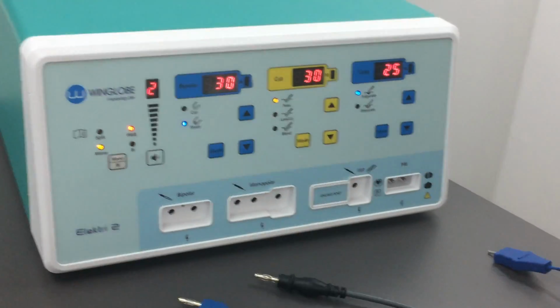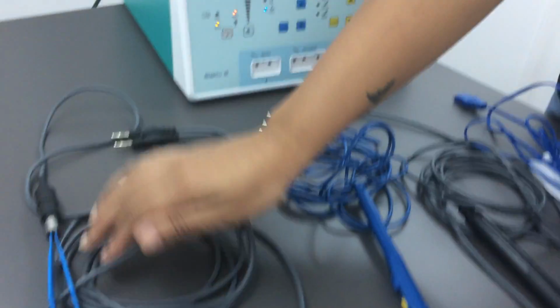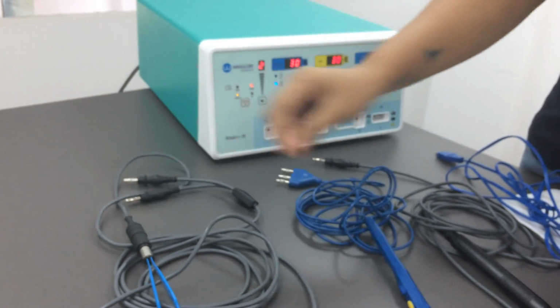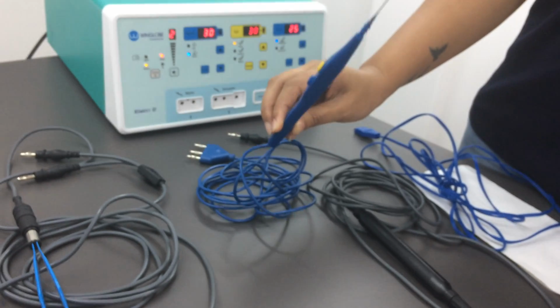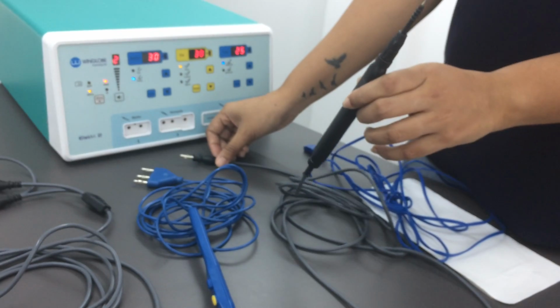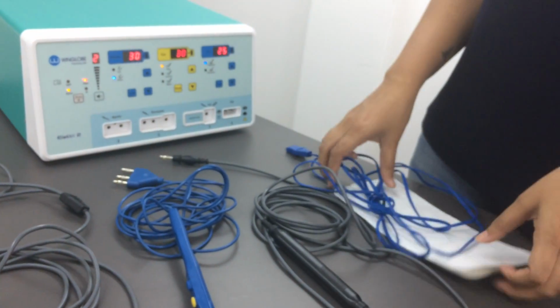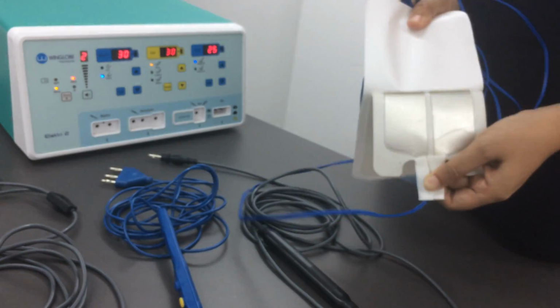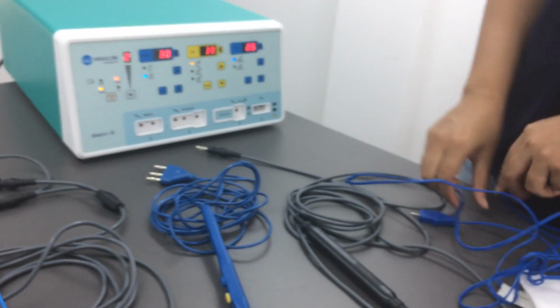The accessories that we've kept here today are, this is an open bipolar forceps with a banana plug cable. Next we have a disposable hand switch pencil. Then we have a foot control reusable pencil. And lastly we have the split return electrode. So we will just connect everything.